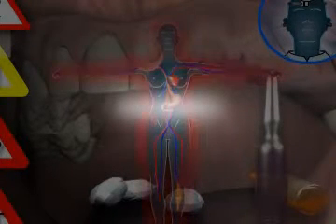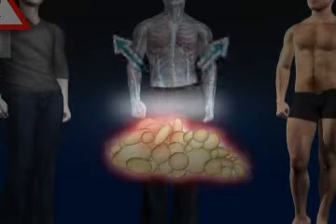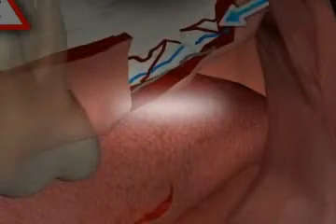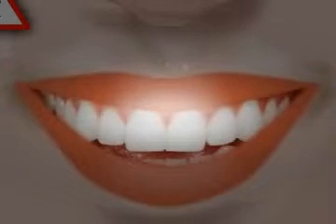At this point, we will only discuss the complications specifically encountered in bone augmentation procedures. These include, for example, the risk of disease transmission when using foreign material, depending on how this material has been processed, the risk of the bone material not growing in, bone infections or osteomyelitis, damage to surrounding structures such as the tongue, cheek, nerves, blood vessels, neighboring teeth, and neighboring roots, as well as any corresponding consequences. Luckily, such complications have become very rare due to the combination of positive developments in medicine in the last few decades and more precise surgical preparation.